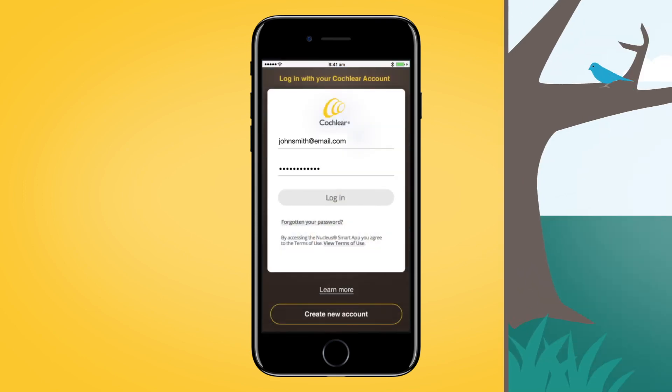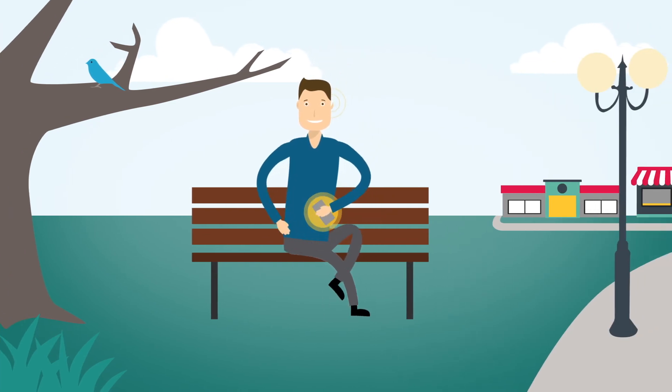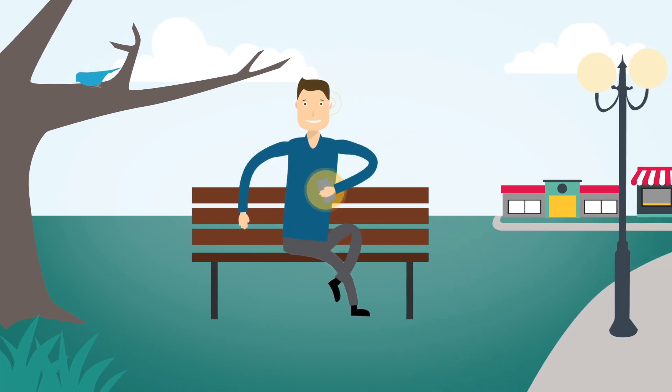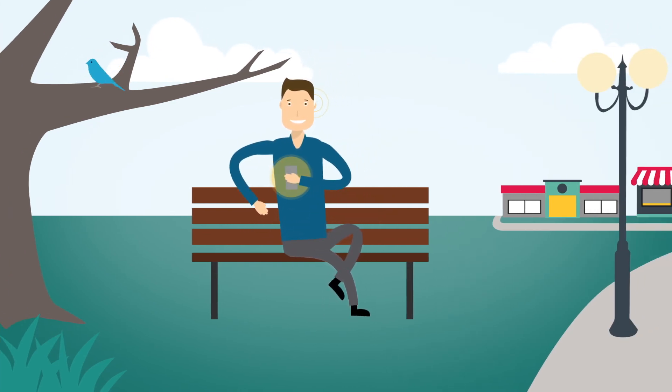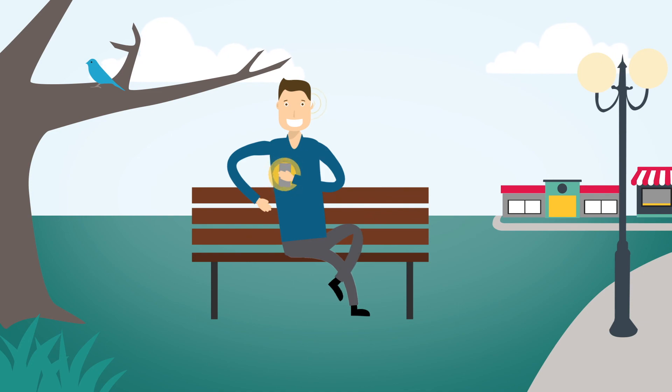When you have signed in, your processor will automatically be recognised by the app.